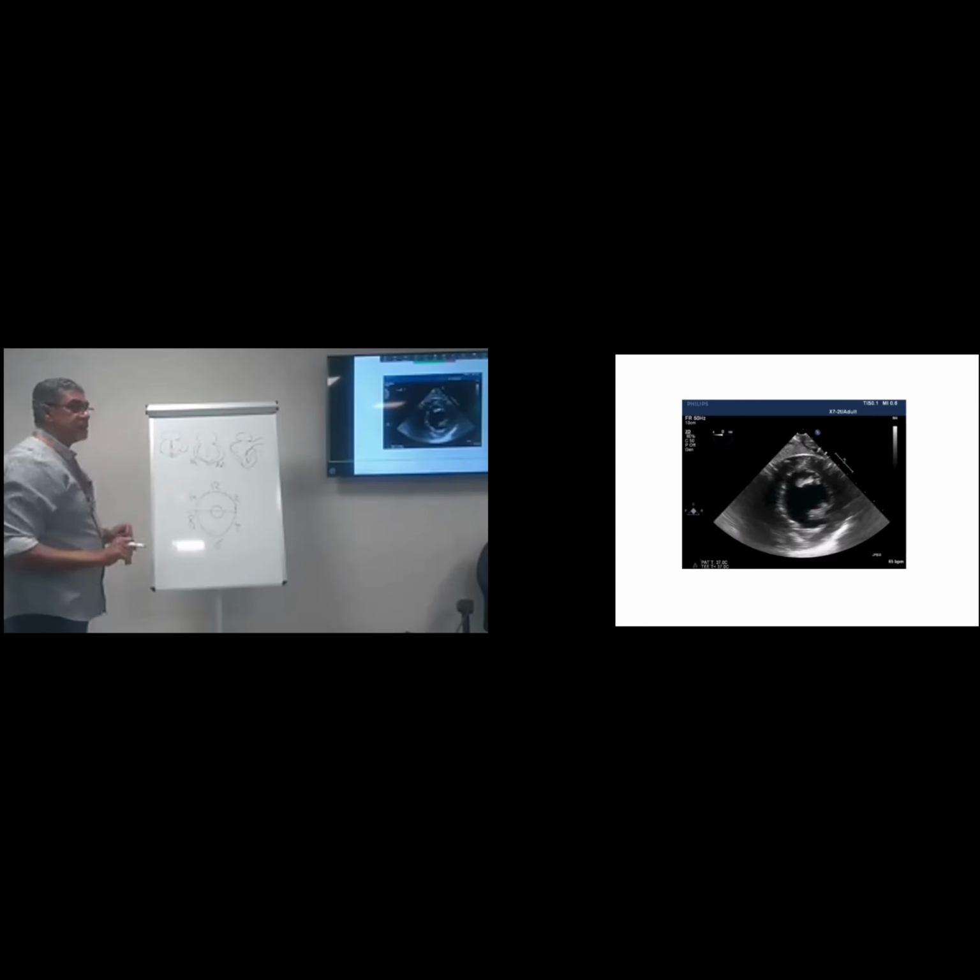Okay, that's it. So right hand anterior, left hand inferior, like sunnah. Right hand, the anterior wall, is more important than the inferior wall. So the anterior wall is the right hand, the inferior wall is the left hand. That's all. Let's go now to the view.